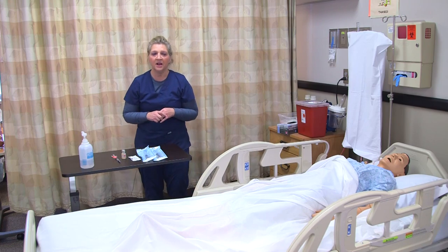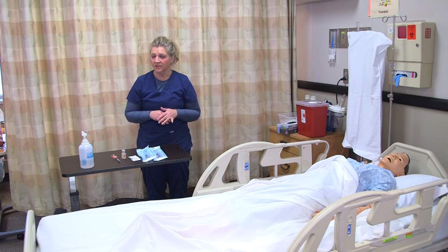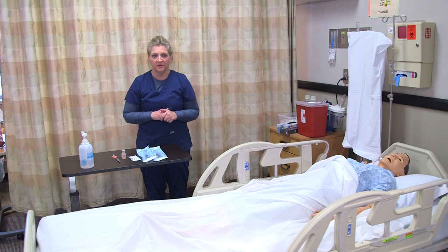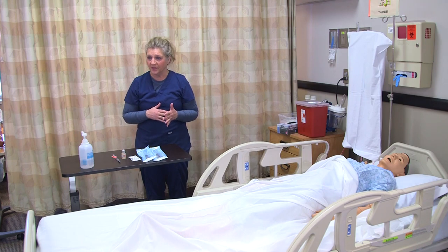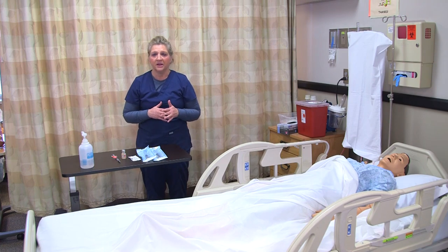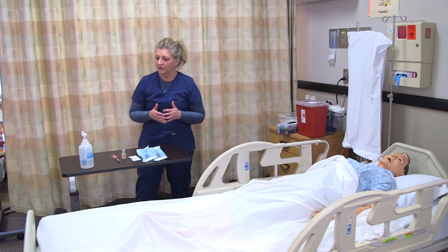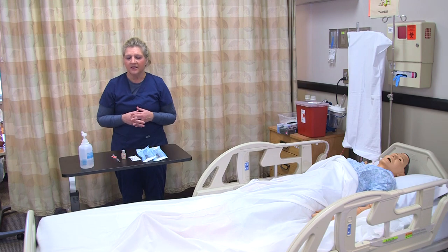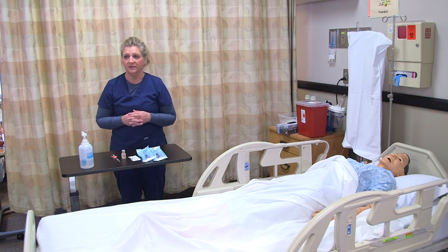Prior to coming in the room, I checked the provider's orders and I am to give an IV bolus of a medication that has been ordered for this patient. Prior to drawing up my medication in the med room, I checked to make sure that this patient's condition is appropriate for that medication. I did any previous assessments needed and checked for allergies — all checked out well. The patient is getting this medication; it is indicated, they are not allergic to it, and they have a saline lock so I'm going to give it IV push as ordered.